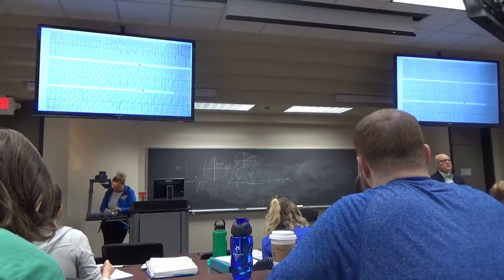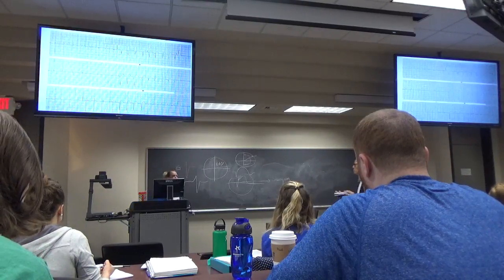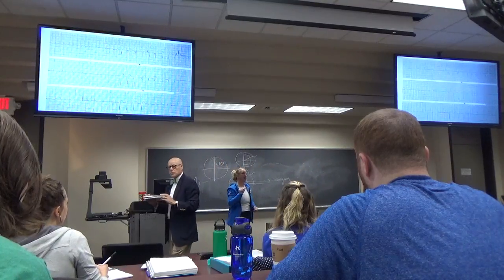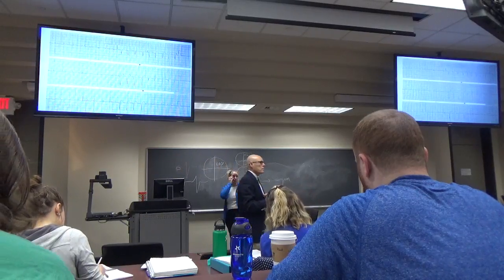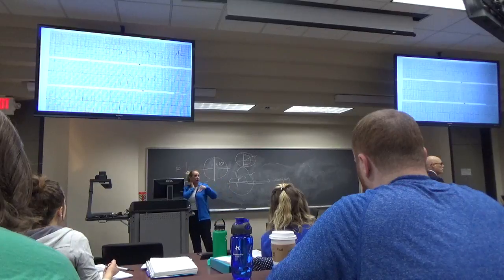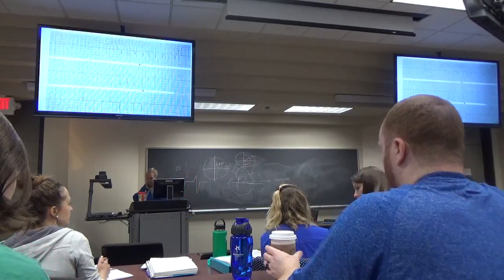Okay. Anything else? I want to make sure that when you guys are calling him an MI, that it's going to be infarct on your test. That it won't say MI. So use the words, or try to use the words, infarct when you're seeing that, and ischemia when you're not seeing an MI. Okay. So that you keep that straight.